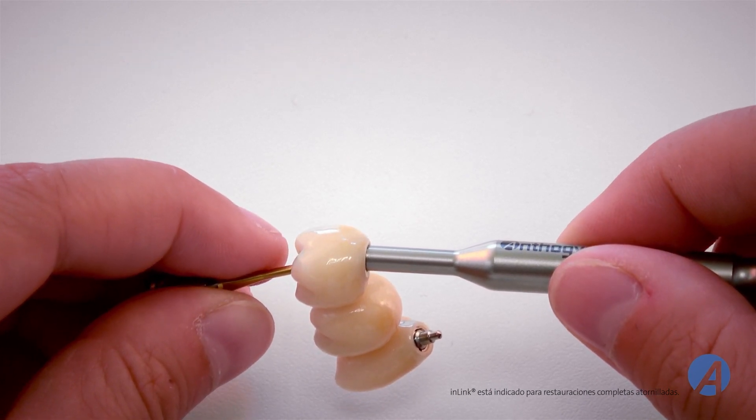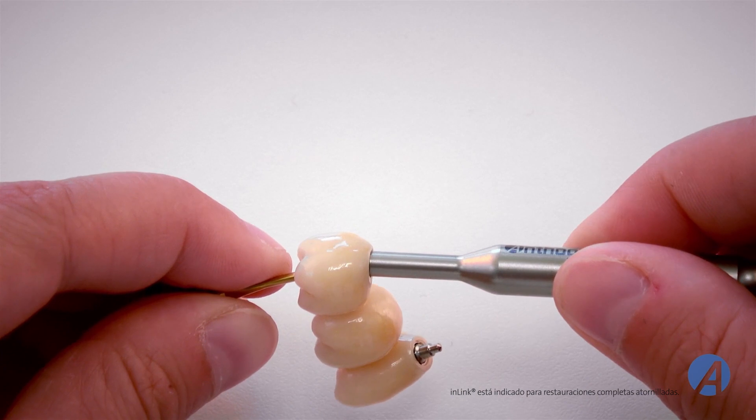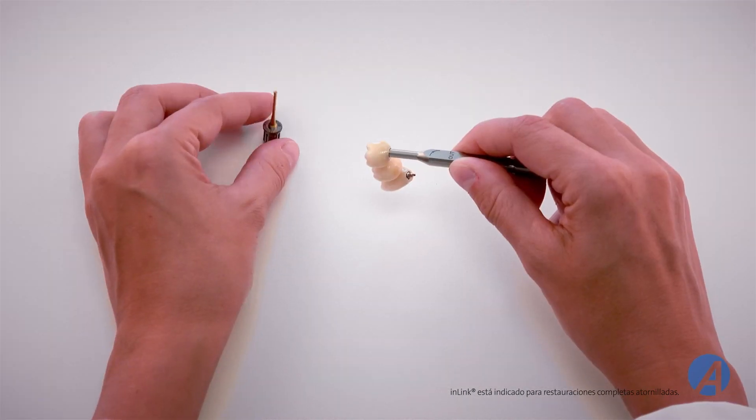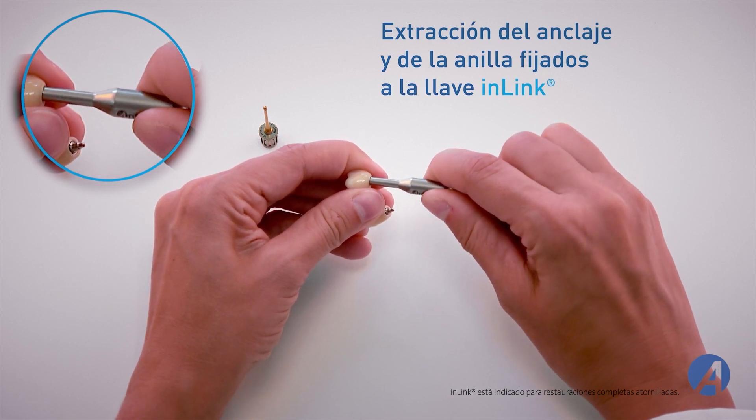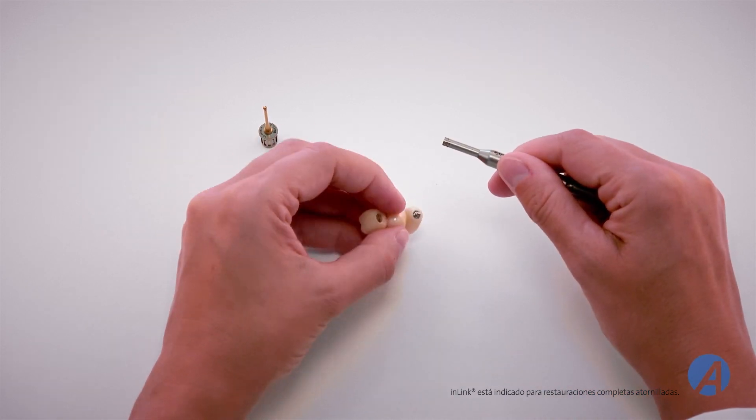Ahora puede retirar la llave esférica. Mantenga la prótesis sujeta. Al tiempo que retira la llave in-link, gírela en el sentido indicado en el esquema. El anclaje sale de la prótesis fijada a la llave.